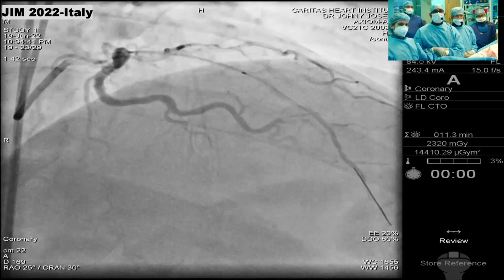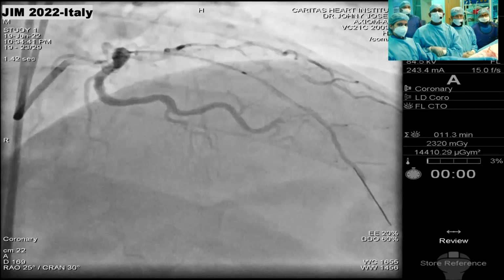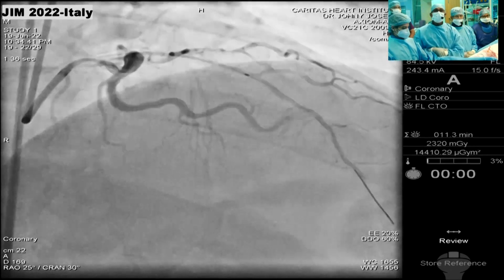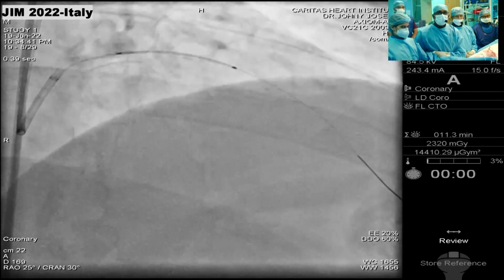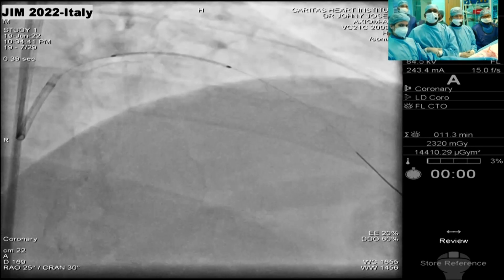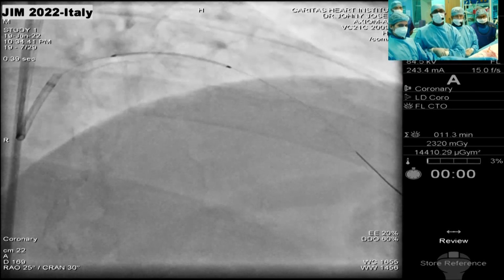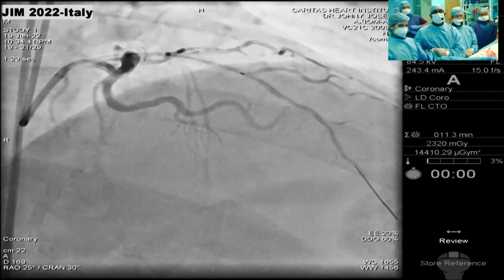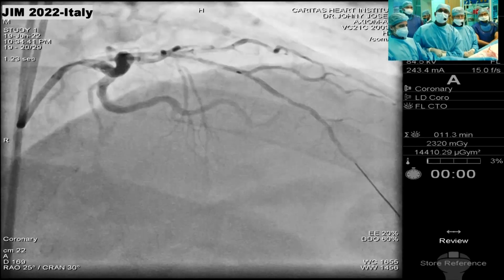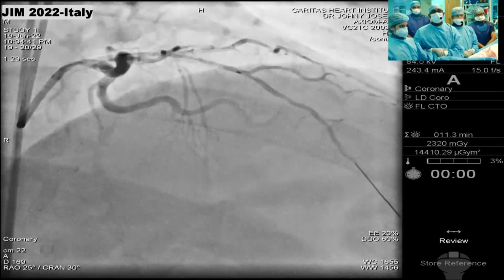Deepak, just one doubt. Yes, sir. Didn't you dilate further? You just went up with the initial 2.75 balloon. Yes, you have dilated with 2.75. And the calcium was mainly limited to the area of total occlusion. Yes, sir, very true. The calcium was mainly at the total occlusion. And when you dilated the balloon, the waist gave way relatively easily, right? Yeah, even at 10, 12 atmospheres, we were able to open it up. Okay, then that means we are having a relatively good position now. Please, yes.